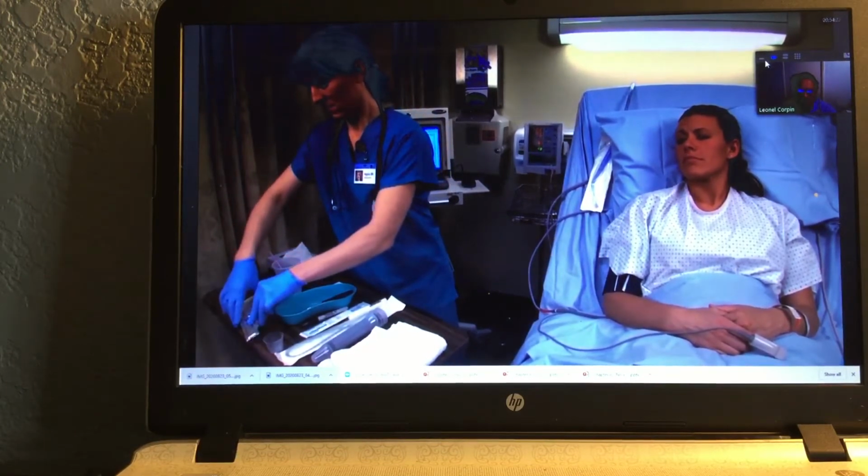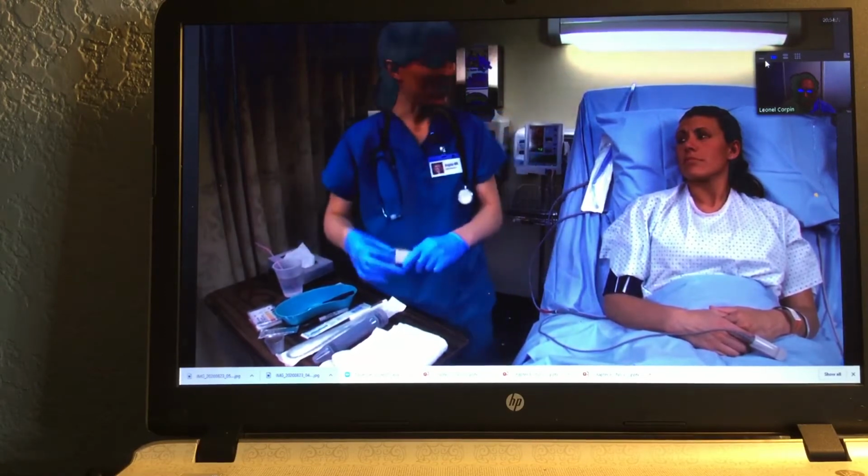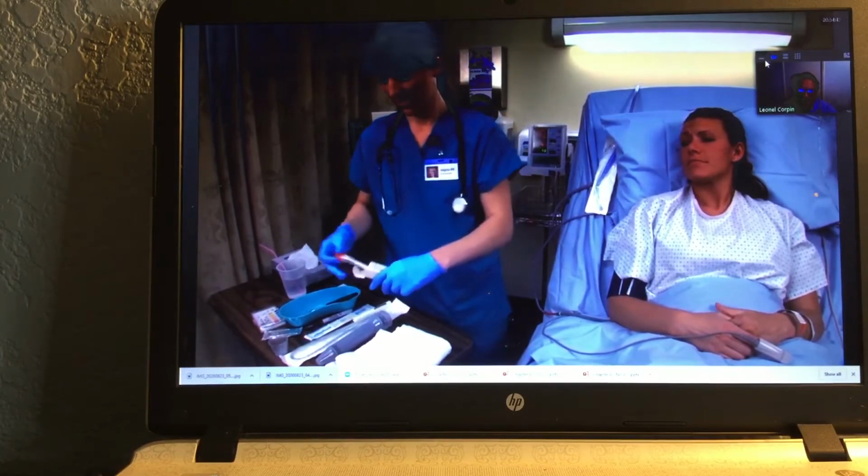Arrange your supplies and equipment. You need a stethoscope, a pen light, and a bath towel for your client. You need an anesthetic agent, if allowed at your facility.